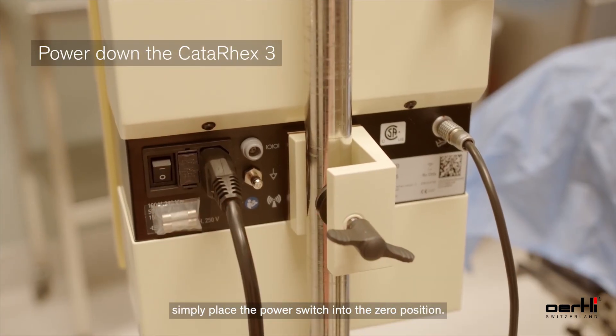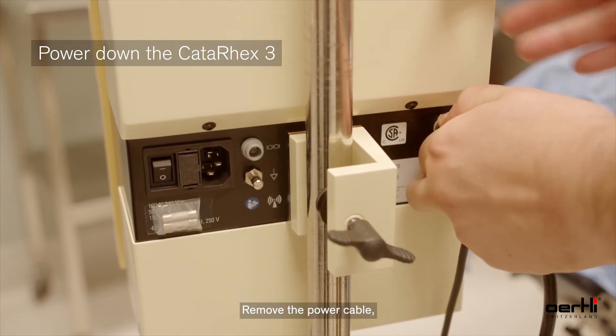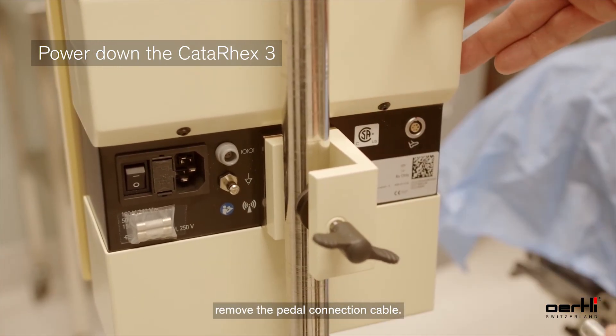To power down the device, simply place the power switch into the 0 position. Remove the power cable, then remove the pedal connection cable.